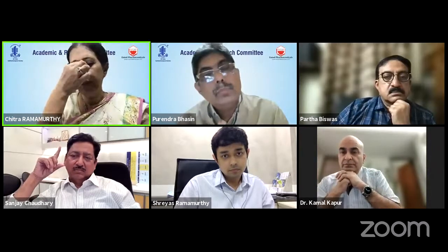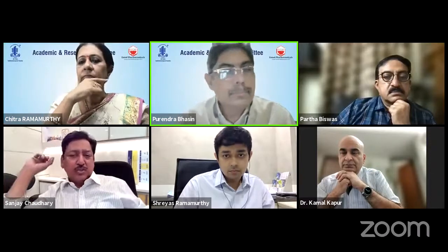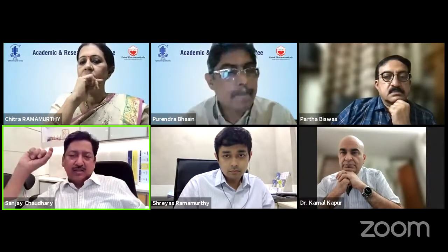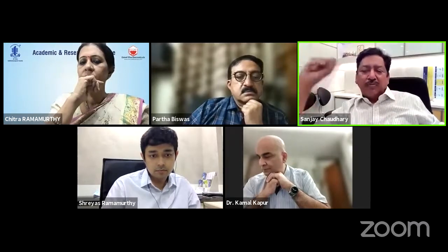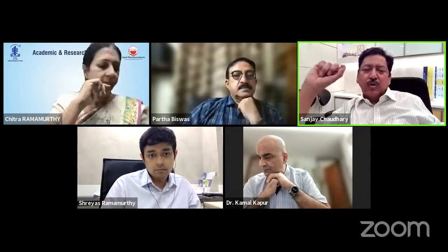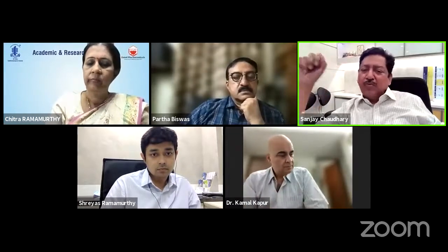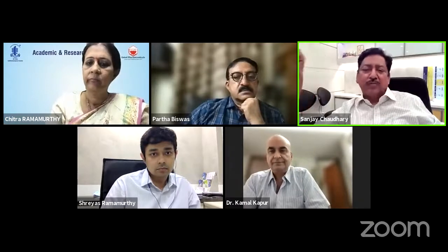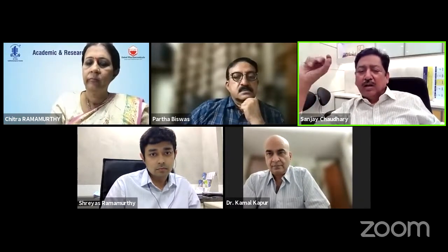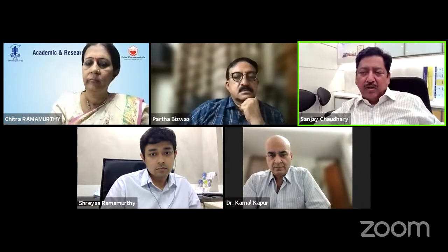Dr. Sanjay Chaudhary, yeah. So first, the issue of a flat vault, that means a very low vault. We have to know that ICL has a natural vault of about 85 microns, which means even if it is totally flat on the crystalline lens, it will still have a vault of 85 microns. Now, the question is whether we explant it or not.